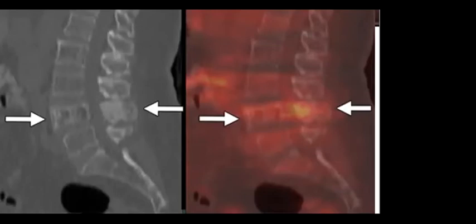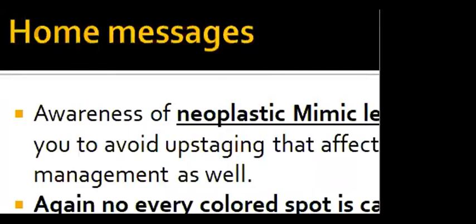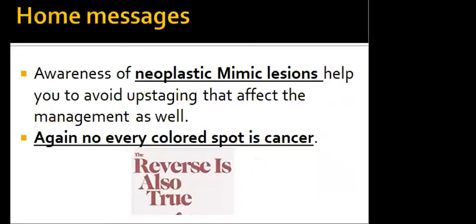So let's go to the take-home message in this case. You should be aware of neoplastic mimic lesions, so that you are confident not to upstage and affect the management. So not every colored spot is cancer, and the reverse is true.